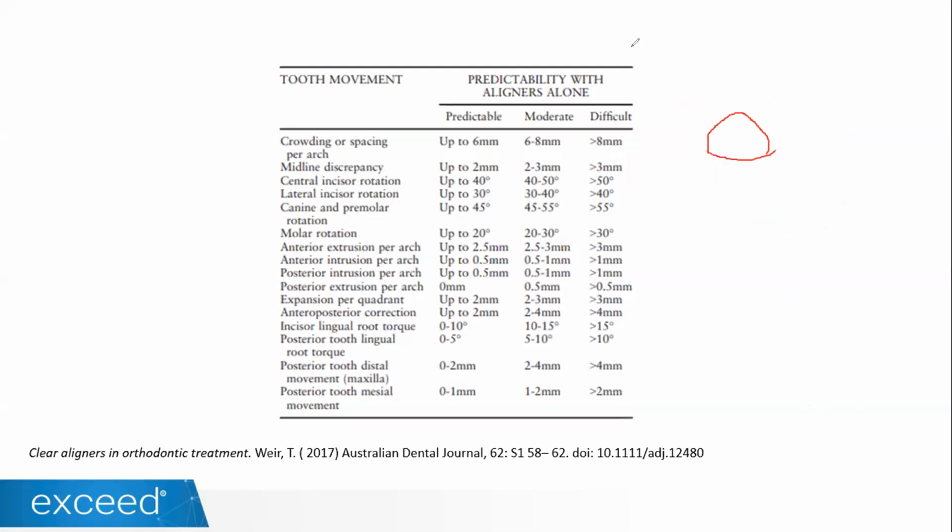You have the gingiva very high, normally in those lower ones. So in those situations, what can you do? You can go ahead and, instead of using, for example, those two elastics, you can only use one. So you can bond a button on, let's say this is the second premolar. This is the first one. So you can bond a button in here and here, and in these situations we use a chain elastic. We don't use a regular rubber band.